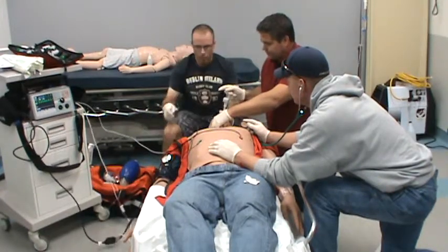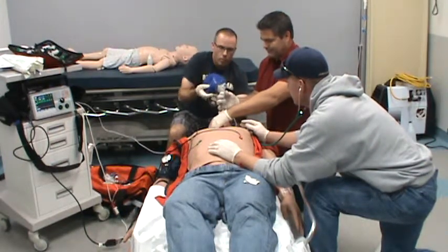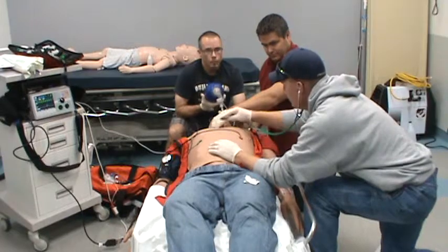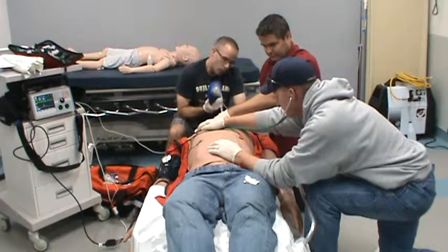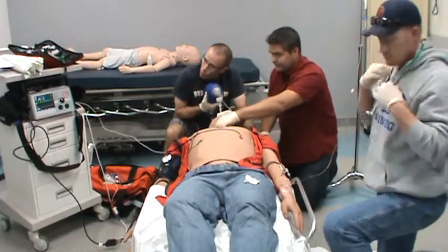Feels pretty good going in. Okay, clear. Okay, good. Clear. I do see some misting in the tube. And how's our waveform look? We do have waveform.